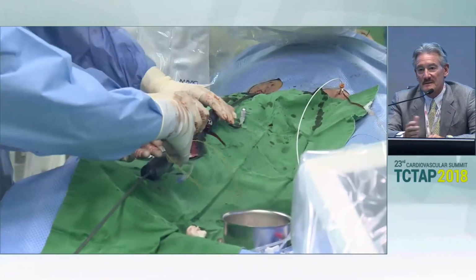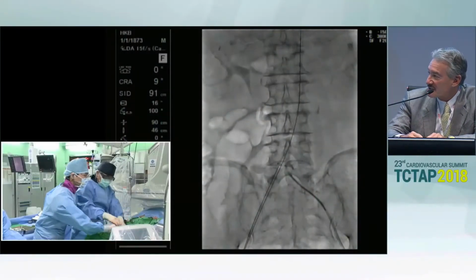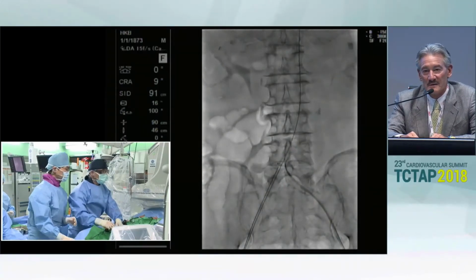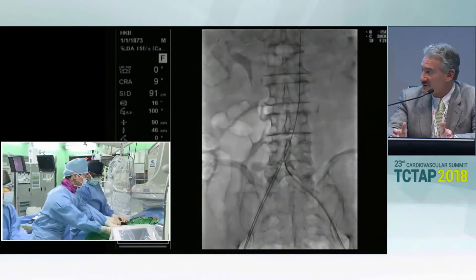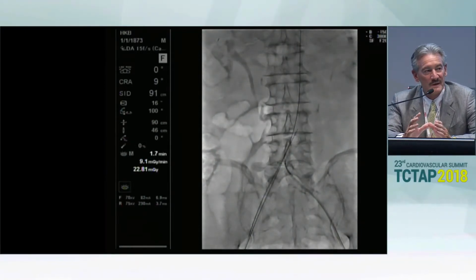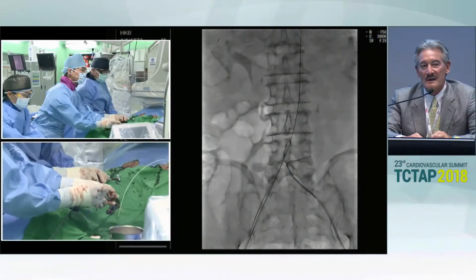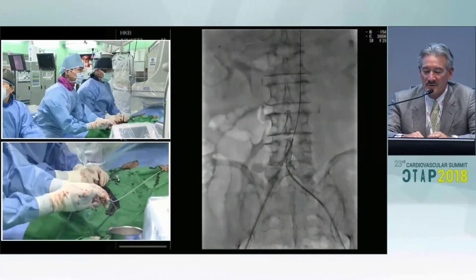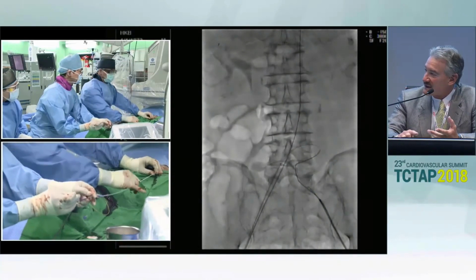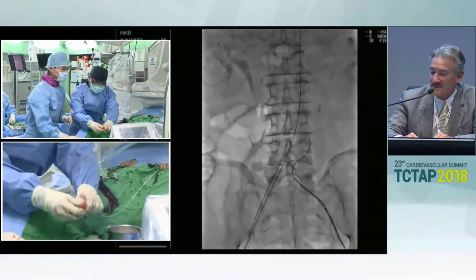This has also just one, I would say, relatively adverse feature, that being an angulated neck. It does not have multiple adverse features, and appears to be within the IFU of the device. As we know, endograft performance is also affected by whether you are treating anatomy that is outside the IFU rather than inside the IFU. And this, I think, falls well within the IFU of the device. So you have the right size, you have the right anatomy, and it's within IFU, so I think it's an indicated case. It's a good case to do.